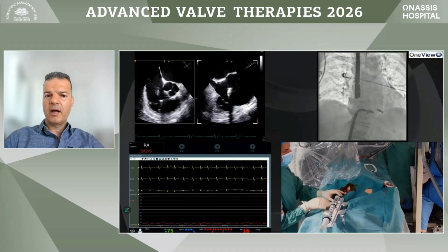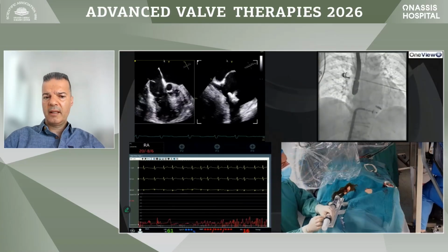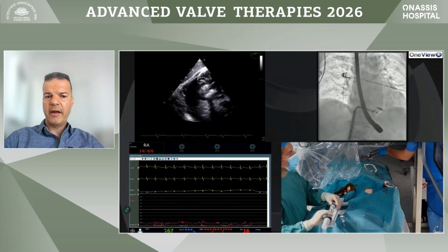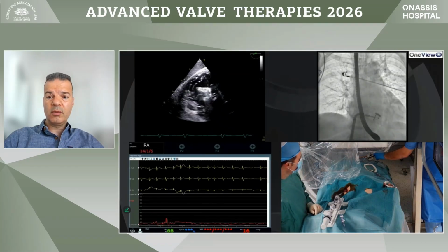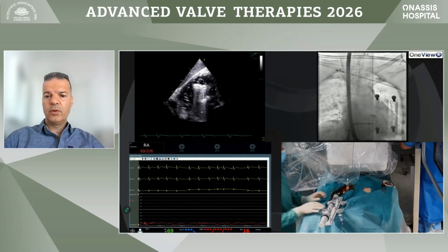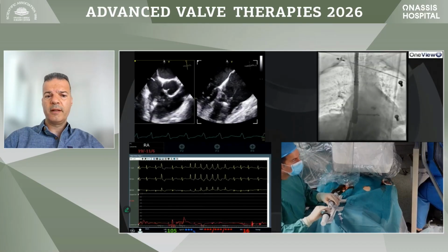And then again, we open the arms of the device and we switch to the transgastric view. Now it's important to find ourselves in the posterior part of the valve here. And we need to make sure that we have very good clocking, so perpendicularity in that particular area is very important. So here we rotate a little bit clockwise. You can see on the fluoro both of these devices are in different rotations, so we have to rotate our image in order to have the second device in profile. Here you can see our clocking is good, and we found ourselves in the posterior part of the valve.